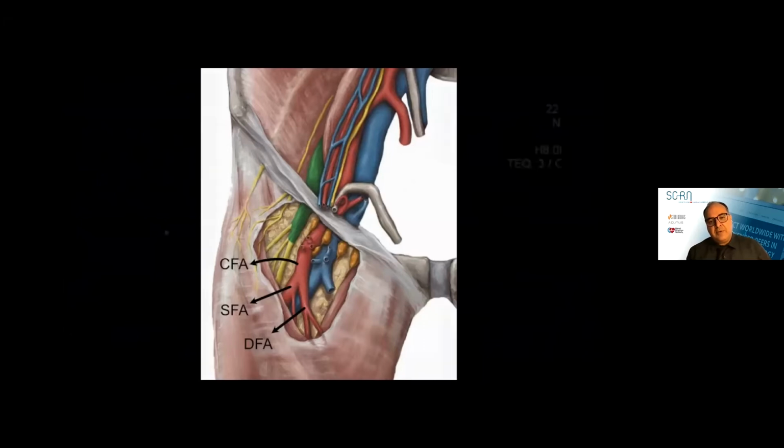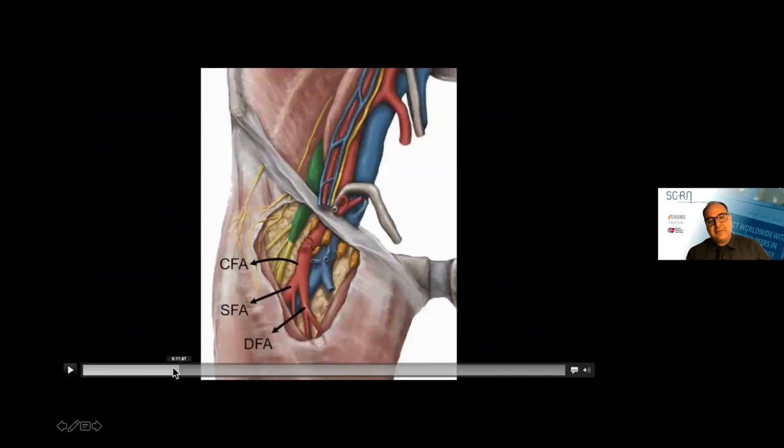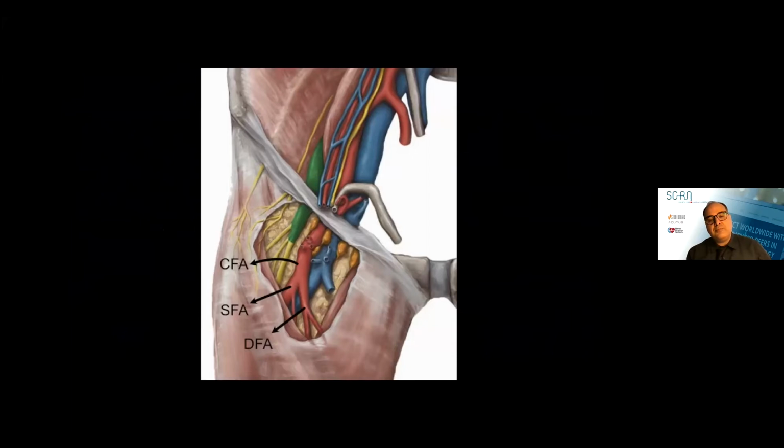As everybody knows, during fluoroscopy, we aim for the head of the femur as a landmark to puncture, so that we are above the bifurcation and avoid the pseudoaneurysm or fistula between the artery and vein. So we don't have that with zero fluoroscopy. Are there any other landmarks that we can use?